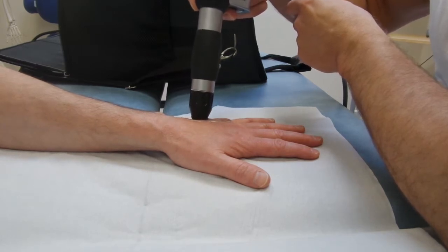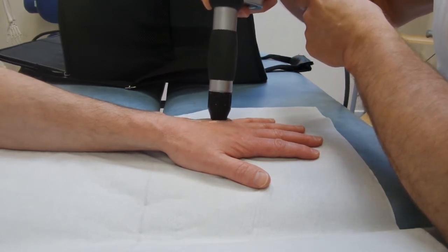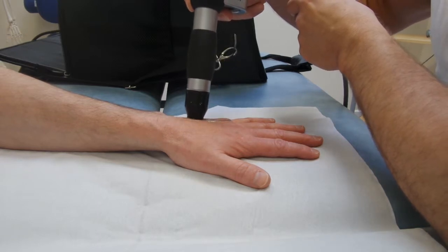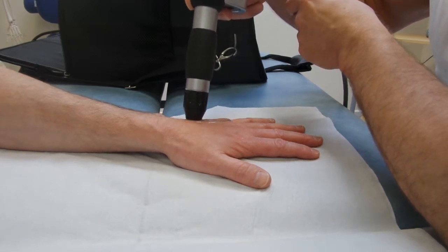This means you're much more reliant on the patient to give you feedback as to where the actual problem areas lie or where the trigger point areas lie.